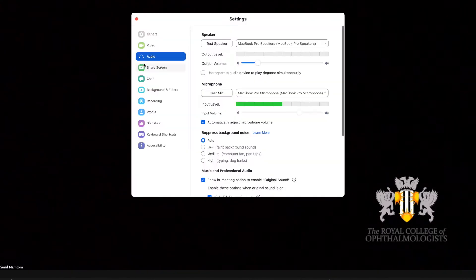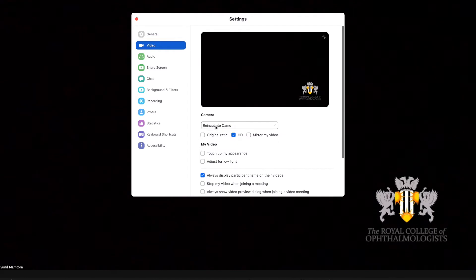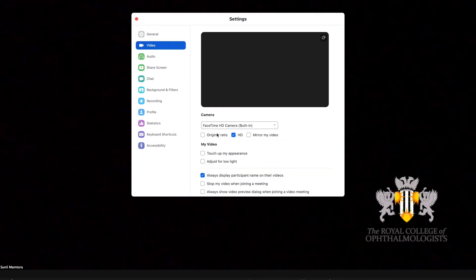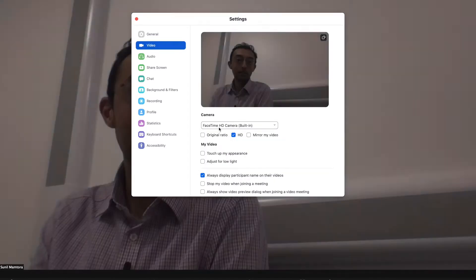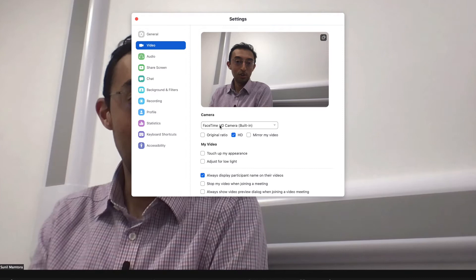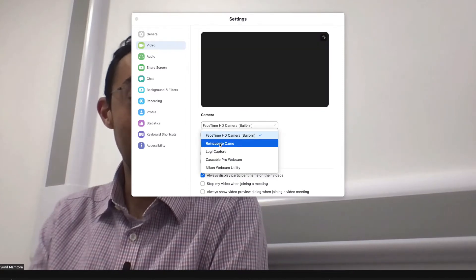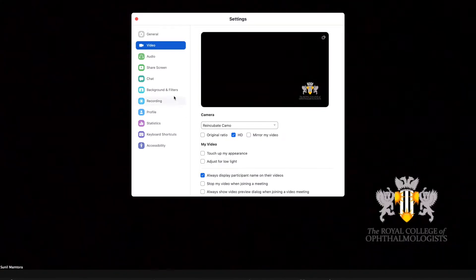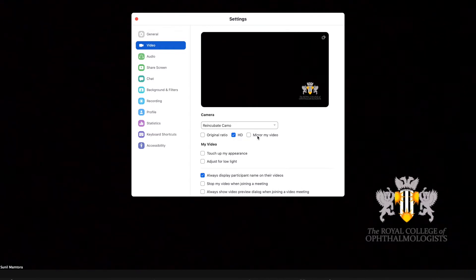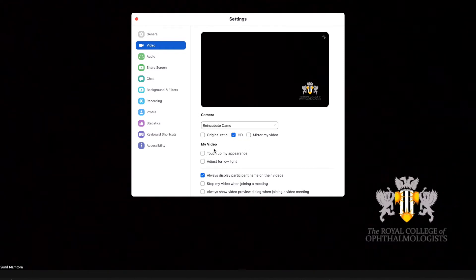The last thing to tell you is how to change your webcam settings in Zoom to integrate with Camo. All you need to do is go to Preferences, then Video, and select from the drop-down box 'Reincubate Camo.' For the best quality image, make sure that HD is enabled, mirror my video is turned off, and touch up my appearance and adjust for low light are also turned off. These settings are best controlled within the Camo interface.